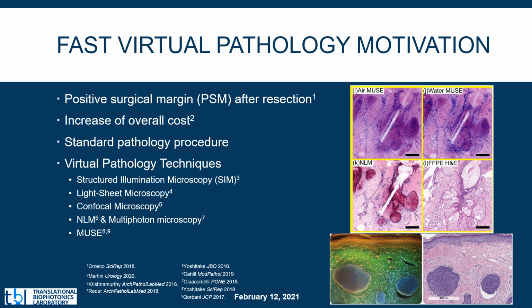However, the majority of these techniques are made to mimic the current histology procedure by imaging small tissue samples. For virtual pathology to be able to make intraoperative diagnosis of surgical margins, it needs to be capable of imaging whole or part of organs with the needed diagnostic resolution in a short time interval. This brings us to a situation where the space bandwidth product of the imaging system is limiting.